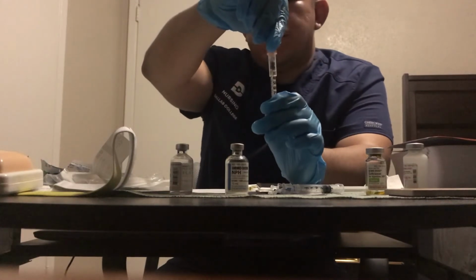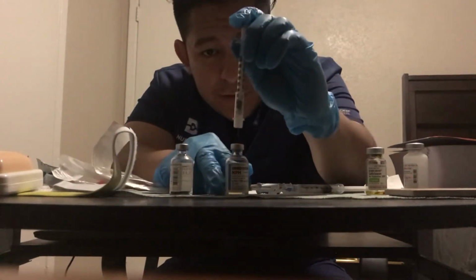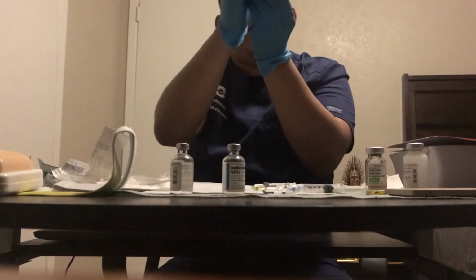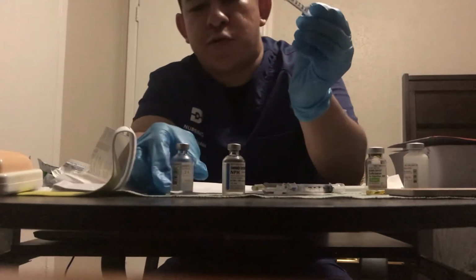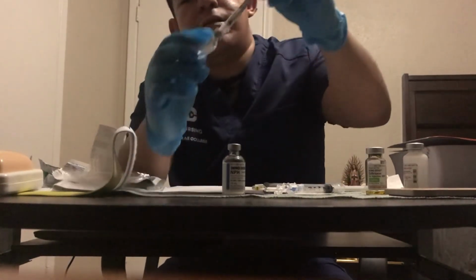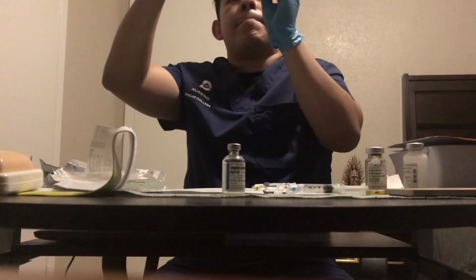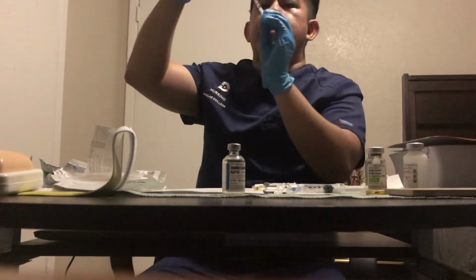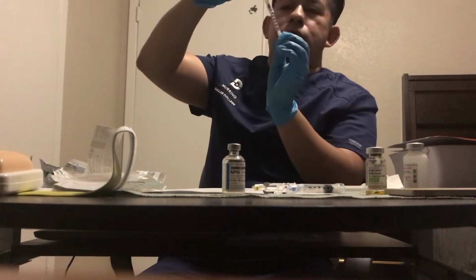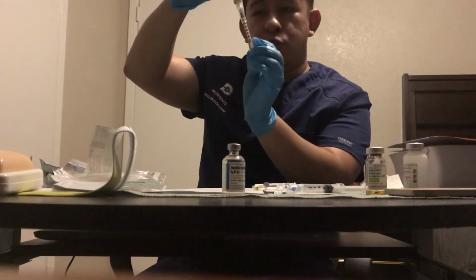Okay, so once that alcohol is dry, we take the cap off. I'm going to inject my 12 units of air. And then inject 12 more units of air now into the regular. And now draw up 12 units of the regular. And as I draw it up, once I have the 12, you have to show a second nurse, hey, can you say that these are 12 units? So a second nurse has to check that you indeed have pulled up 12 units.